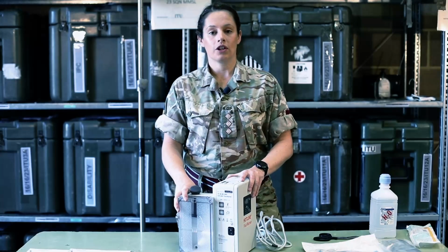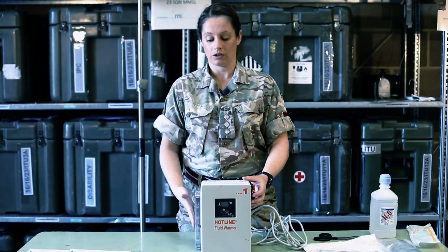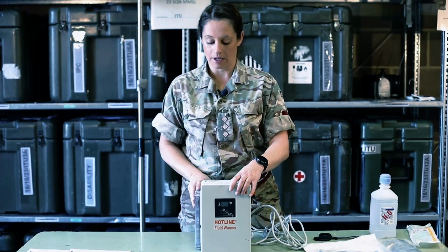So it's really important to note that when you come to use the Hotline fluid warmer, you don't insert the giving set before you've filled the water chamber. This can create an airlock, which will circulate air and can be a hazard.